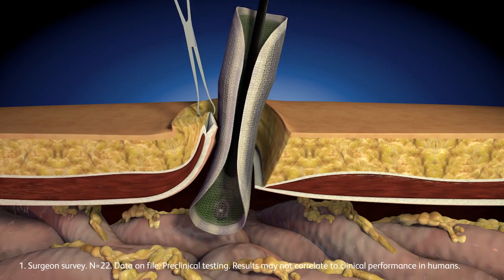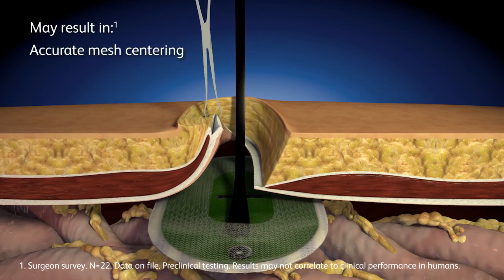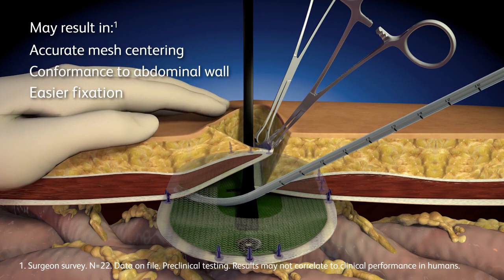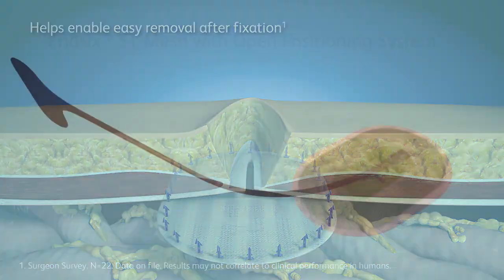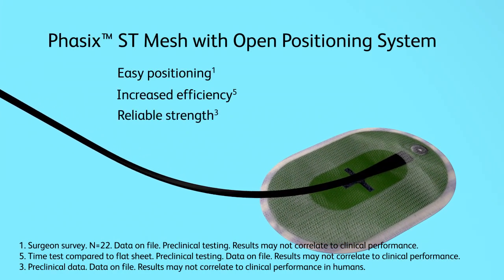The positioning guide is designed to help the mesh maintain a flat shape for accurate mesh centering, better abdominal wall conformance, and easier fixation. The positioning guide is easily removed after fixation.